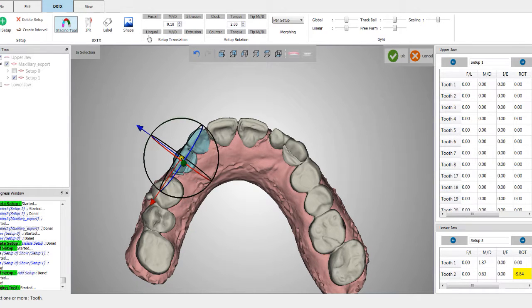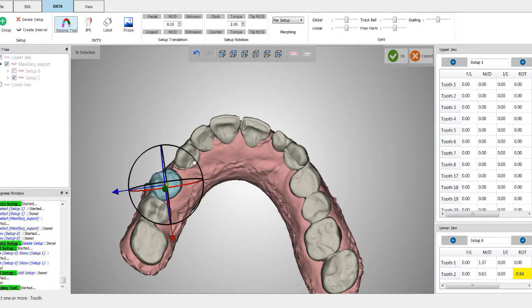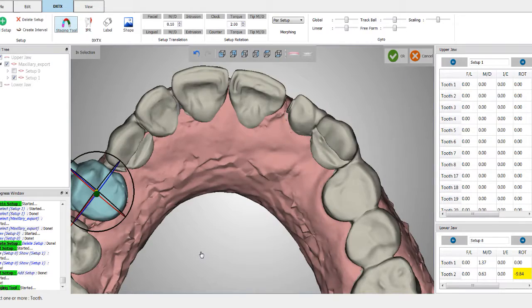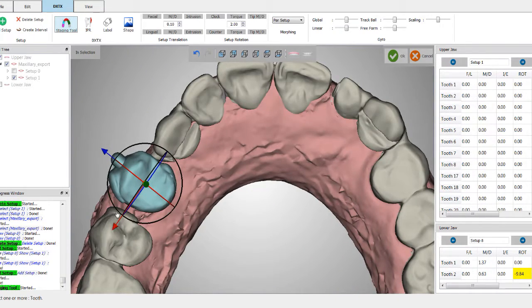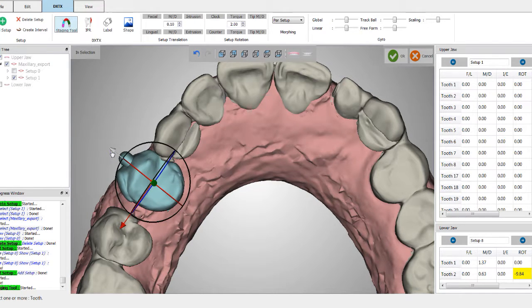I would actually take that whole segment, except that I'm going to unrotate this tooth here. You can see I've already added an attachment to that tooth. And let me just point something out as well here in the software. We've built in, you can see here, this little pad here and this little pad here in between the teeth. Essentially what that does, that's just to be used as a guide, so that, again, we like to create sort of buffers in between the teeth.